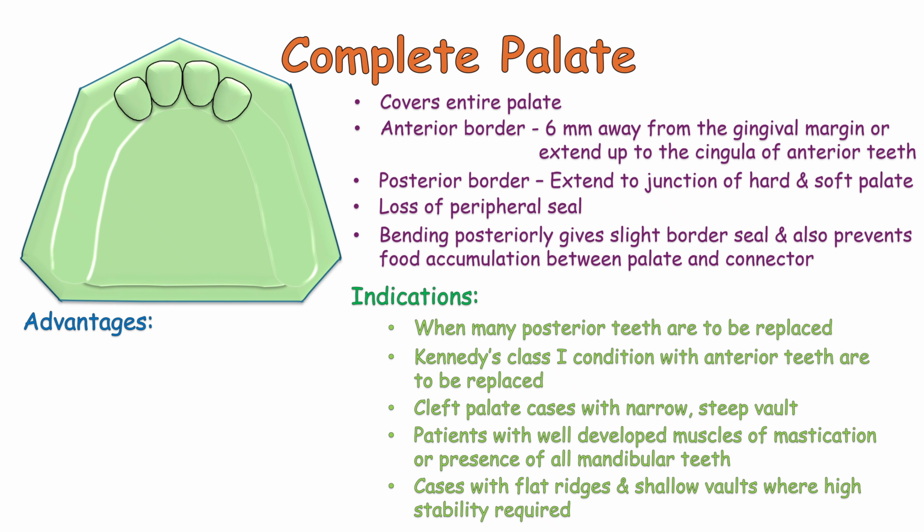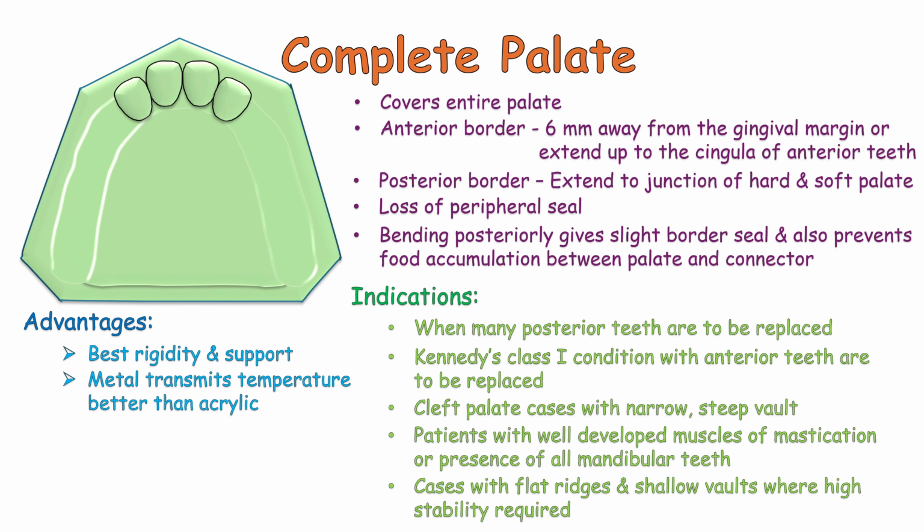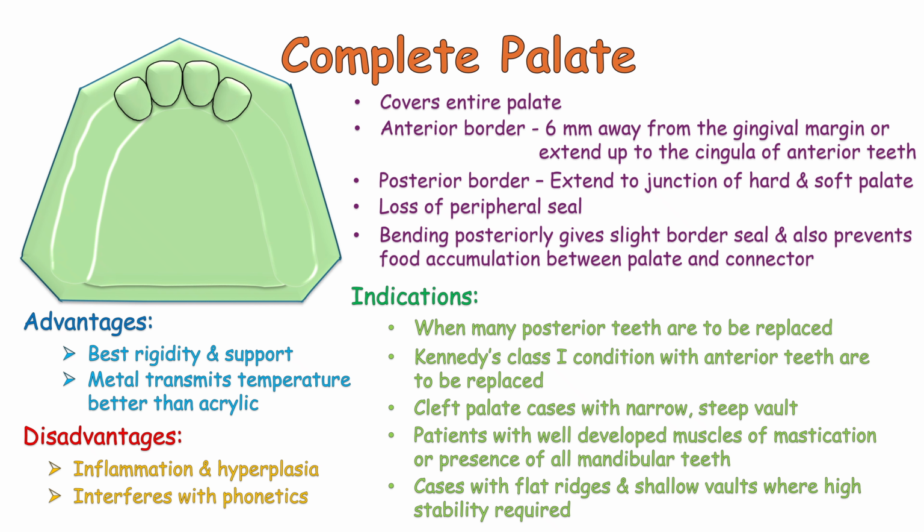Next are the advantages. It has the best rigidity and support. The metal transmits temperature better than acrylic. Then the disadvantages are: it may cause inflammation and hyperplasia. It interferes with phonetics.